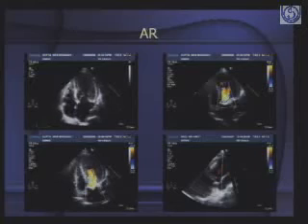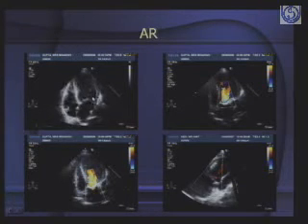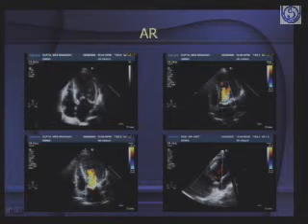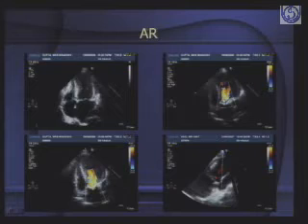Now coming back to aortic regurgitation, you have seen the PLAX view, you have seen the short axis view, then you get the transducer and show the 4-chamber view, good LV. Now here, because you are thinking predominantly in terms of aortic regurgitation, you will definitely have a look at the mitral valve, because mitral regurgitation, mitral stenosis and aortic regurgitation may coexist. And here is an example in which a stream of aortic regurgitation hitting the anterior mitral leaflet causes a flutter of the AML. And you can see the jet very clearly here in the same position.